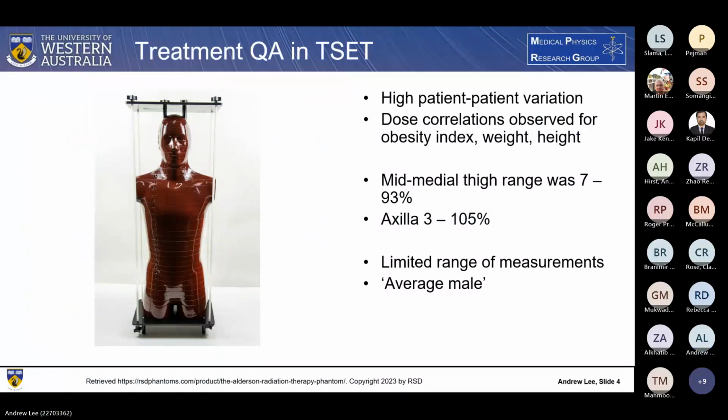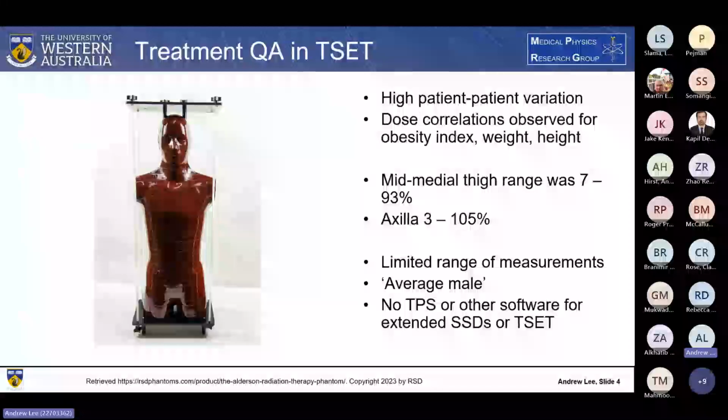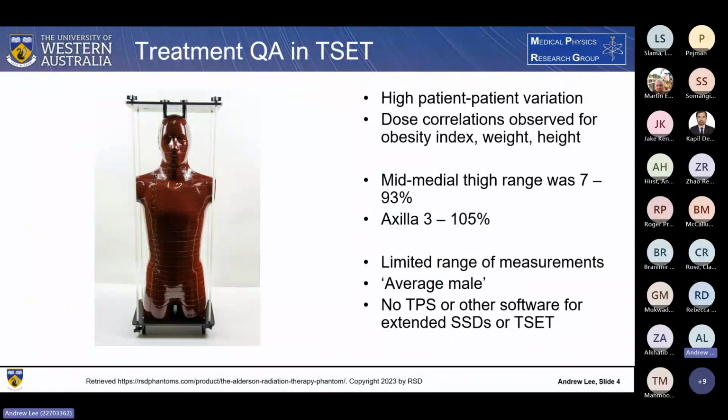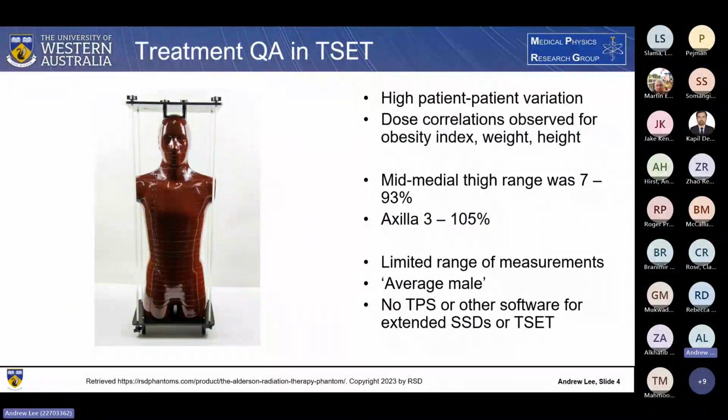And the largest issue is that we do not have a treatment planning software or Monte Carlo simulations really, which we can use for TSET, because we're looking at very complex surface geometry and far SSDs. And so this can lead to issues in our planning and actual treatment delivery.